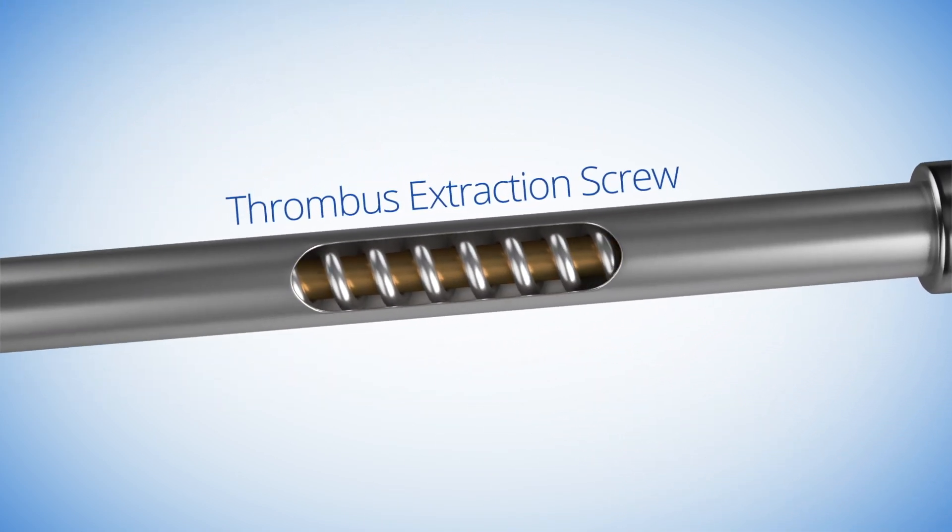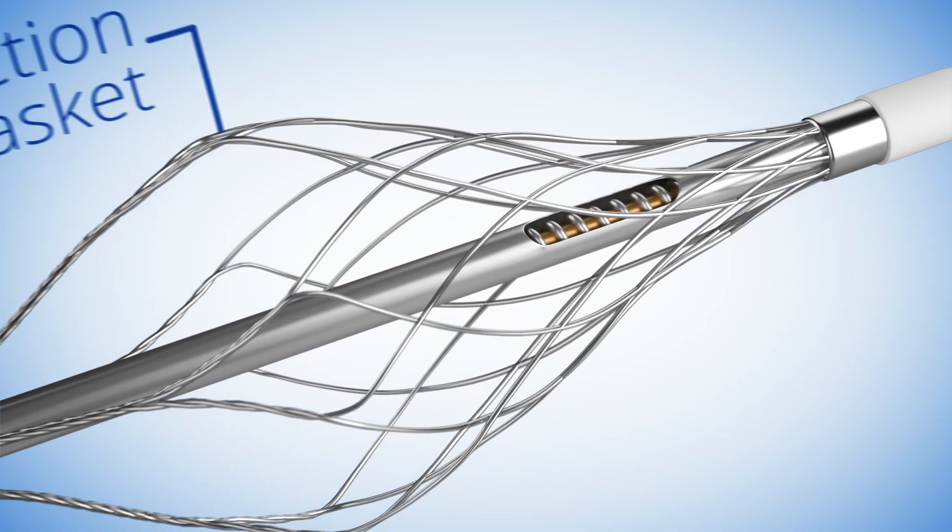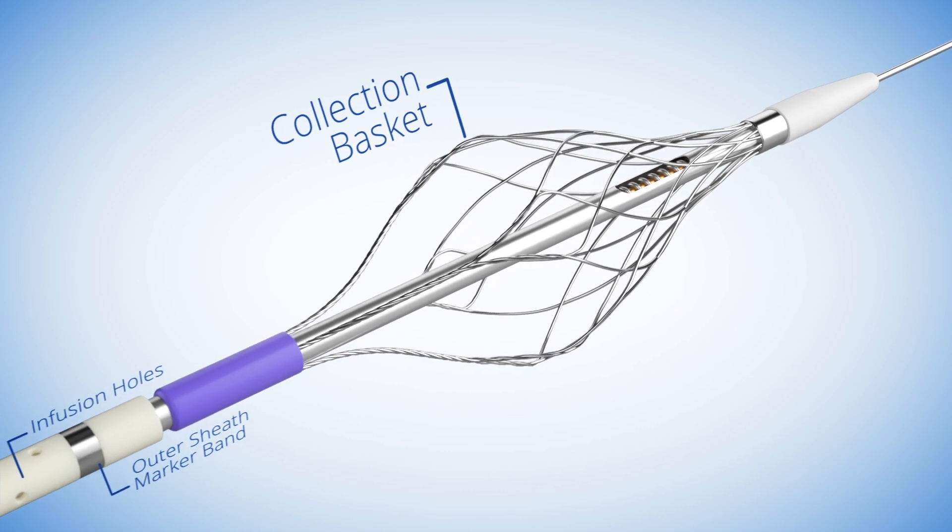The device combines declotting and thrombus extraction functionality into one dual action device designed to facilitate wall-to-wall clot disruption.